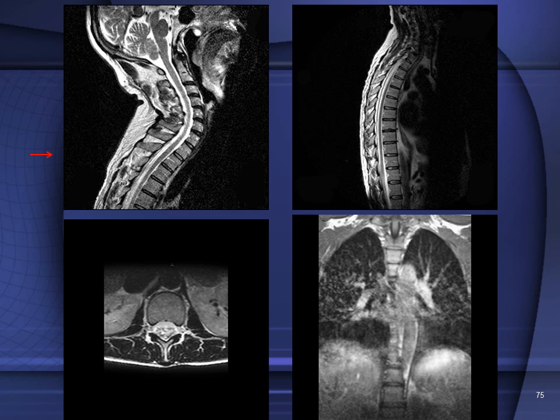In this first image, we have an MRI of the cervical spine or C-spine, and in this case the weighting is that of T2, where fluid is bright and tissue is dark. We see differing degrees of disc dehydration representative of degenerative disc disease. We can also see the cerebral spinal fluid around the medulla oblongata, the pons, and in the fourth ventricle, also in the cerebellomedullary cistern.